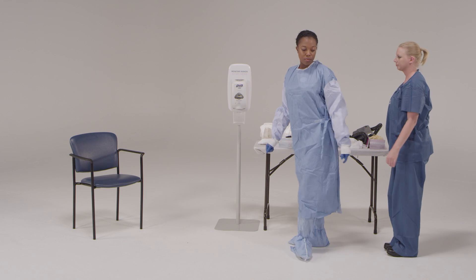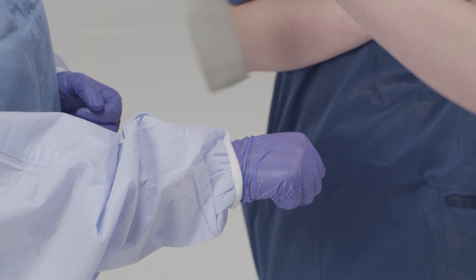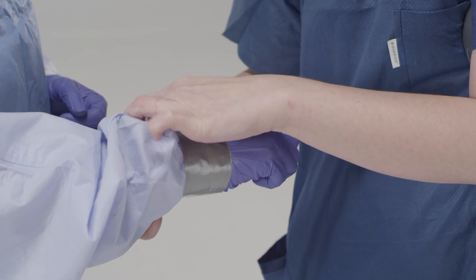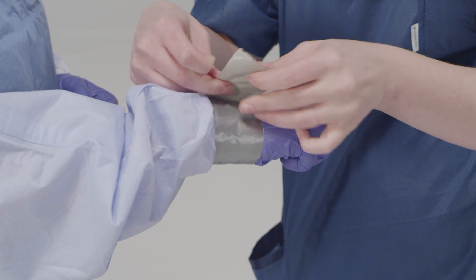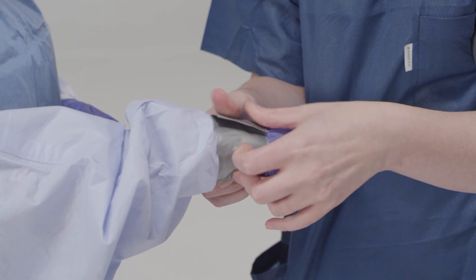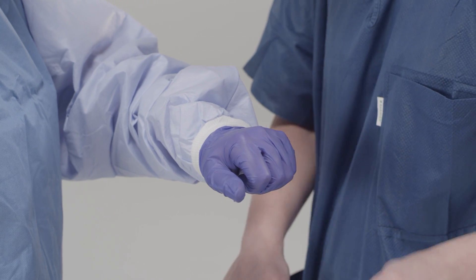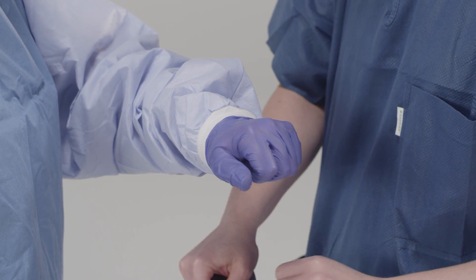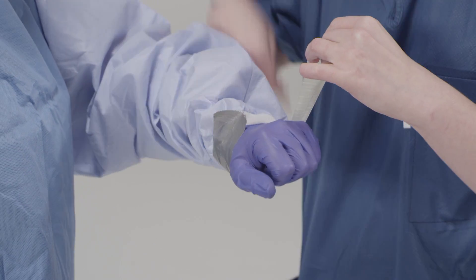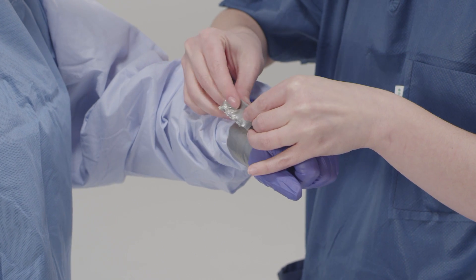Ensure cuffs of the inner gloves are tucked under the sleeve of the gown. If your gown does not have thumb hooks, some facilities may consider taping the sleeve of the gown over the inner glove to prevent potential skin exposure from separation between the sleeve and inner glove during activity. If taping is used, a tab should be created by folding the tape over at the end. This tab will help facilitate easy removal during the doffing process. Care must be taken to remove tape gently. Experience from some facilities suggests that taping may increase risk by making the doffing process more difficult.